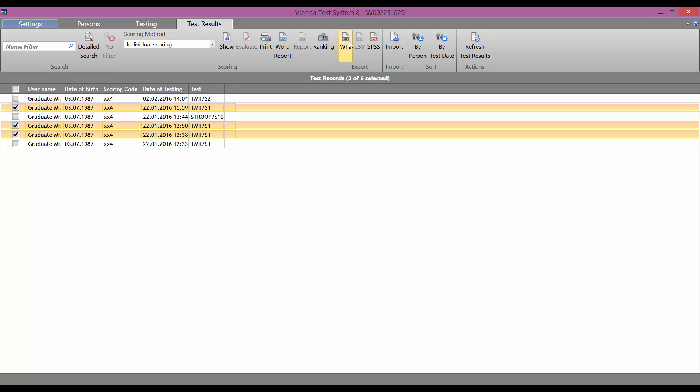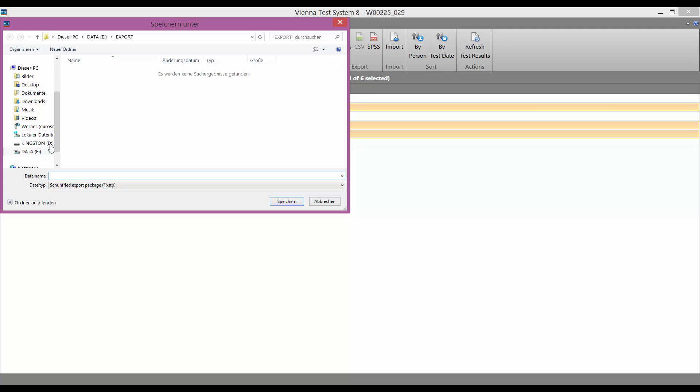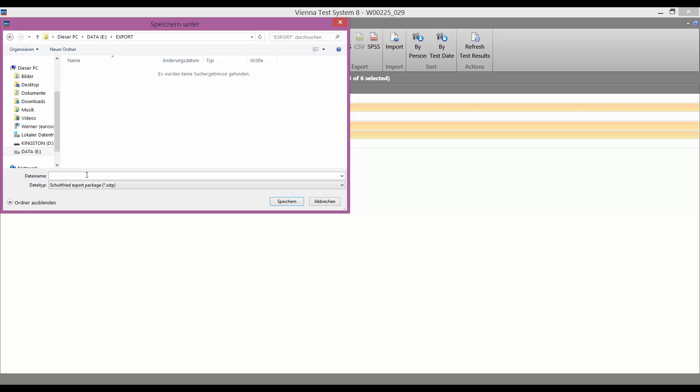We now click on the black and white WTS icon next to export in the menu. We now select where we want to save the export file and give it a name.